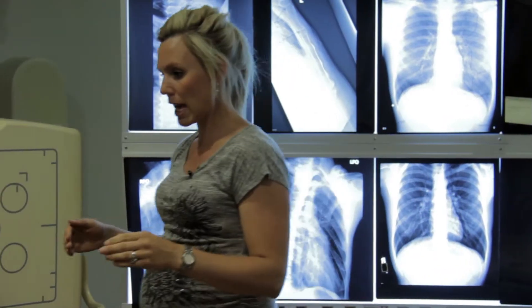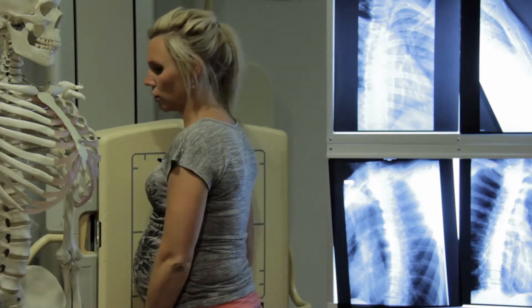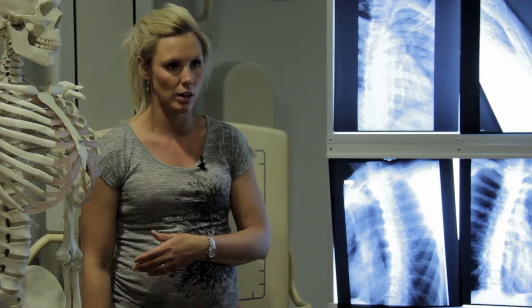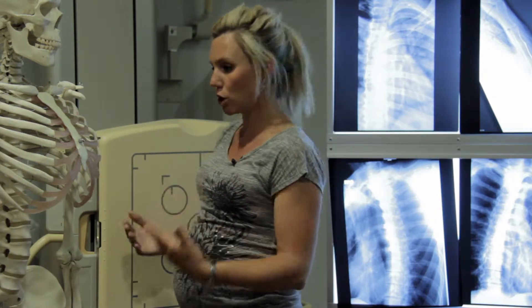Next one is the obliques. Now that we have our straight AP or PA image, if you shot your first picture AP, both of your obliques are going to be posterior obliques. Keep it consistent. Don't shoot your straight one one way and then roll them around and do your obliques on the front. If you shoot your first rib picture PA because their area of pain is on the anterior, do your obliques as AOs, anterior obliques.